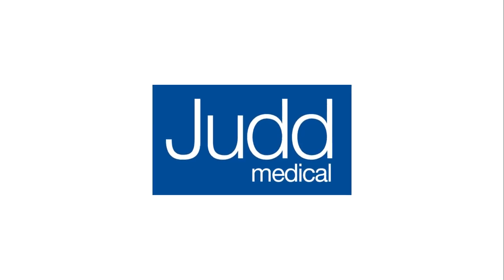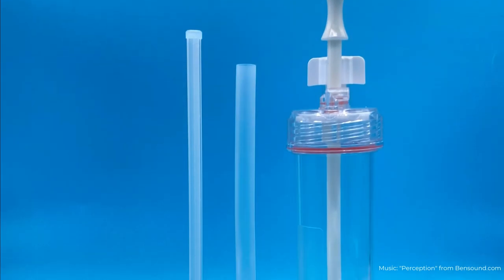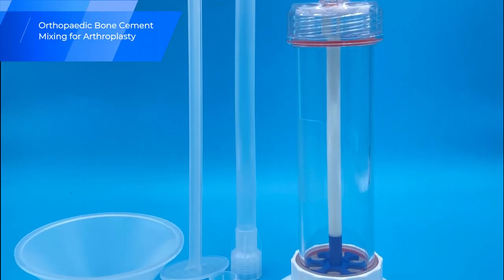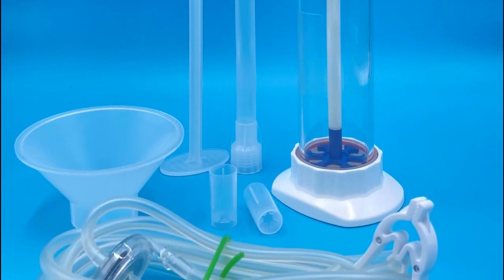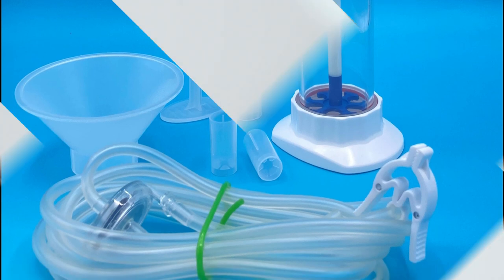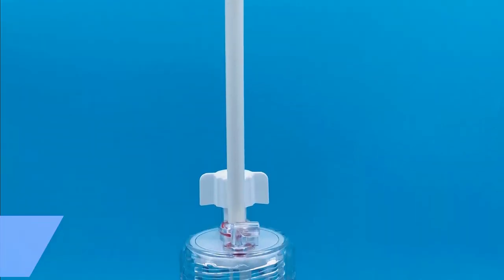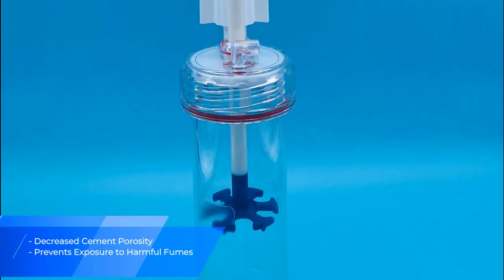In this video, we will be introducing the Solomax Bone Cement Syringe Mixer, which is a vacuum mixing and application device for orthopedic cement. It enables bone cement to be mixed in a sealed manner without human contact or exposure to the outer environment. This is vital for two main purposes, as it decreases cement porosity and prevents exposure to harmful fumes.